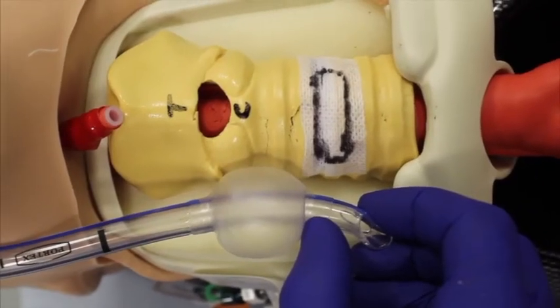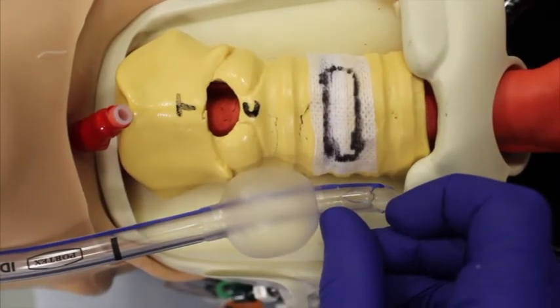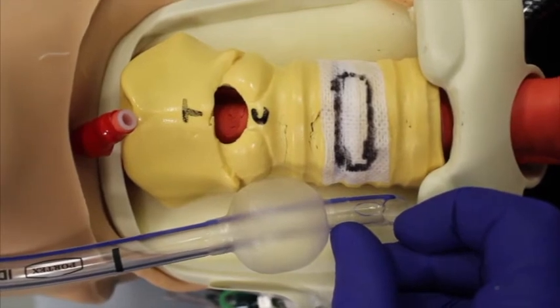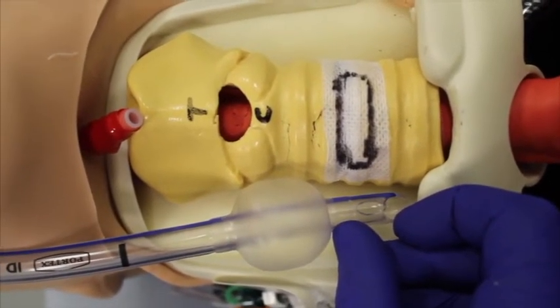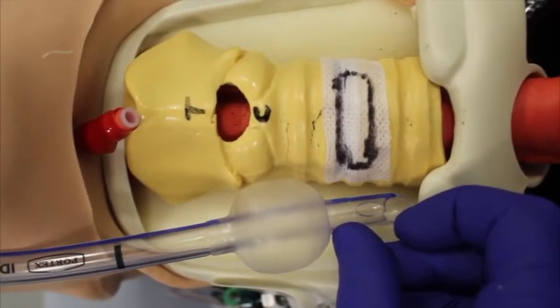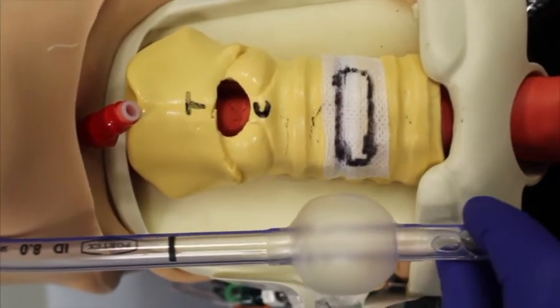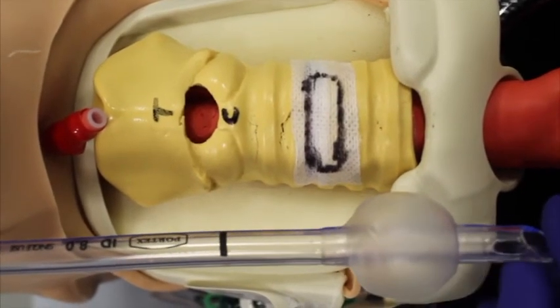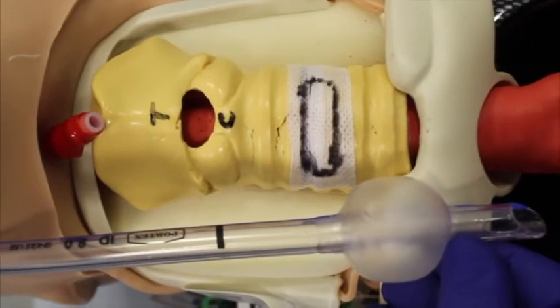At this stage of the proceedings, the trachea has been completely exposed but not perforated, and the endotracheal tube still sits in a just subglottic position. The anaesthetist will be asked to push the tube towards the carina, a determined distance from the preoperative chest x-ray. This can be done without cuff deflation to prevent aerosolization.